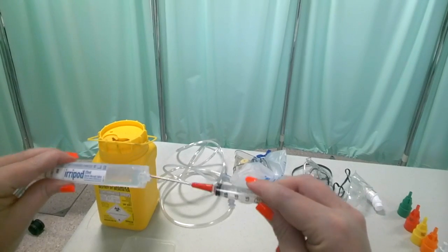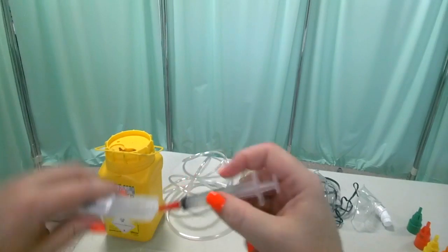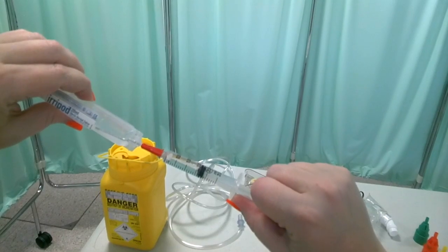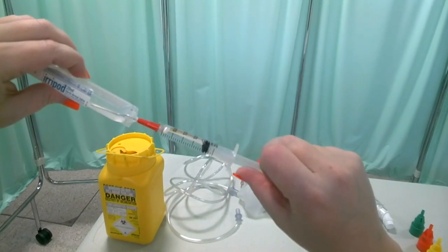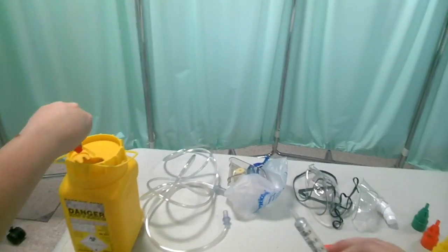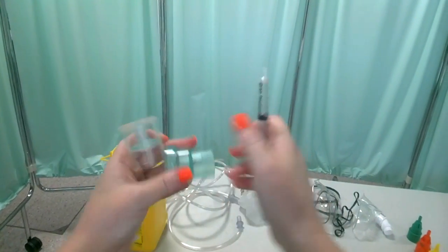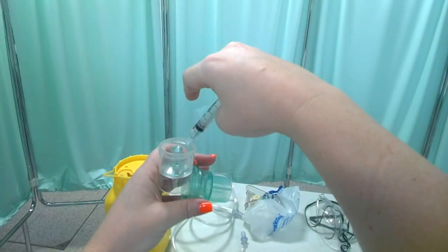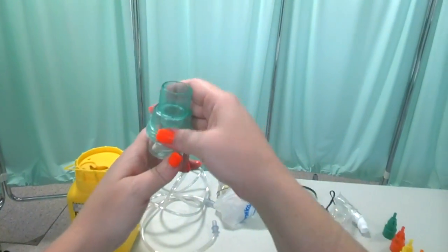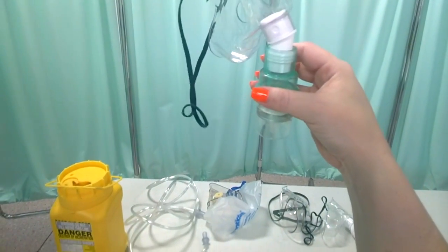Alright, so let's just assume I'm going to nebulize a couple of mils of saline for this particular patient. So you can see there I've drawn up a volume of 2 mils. Alright, get rid of that into the sharps bin straight away. And this is where we open up the nebulizer chamber, introduce the liquid into the chamber, close it up, and then attach the mask on. Alright, so we have the complete unit there.